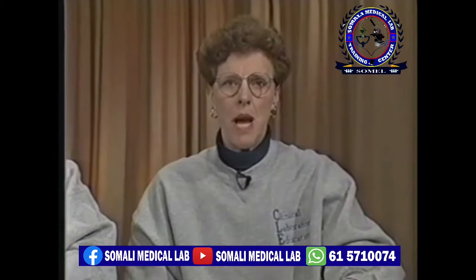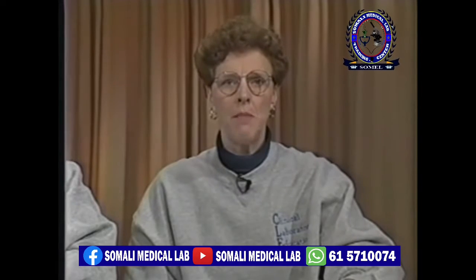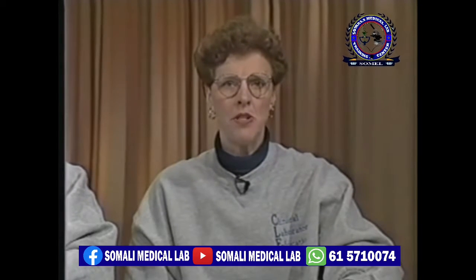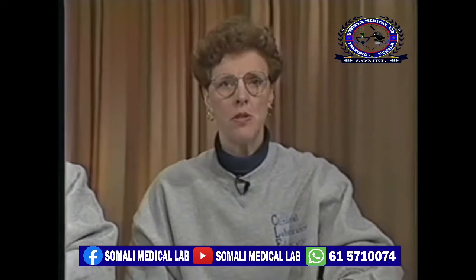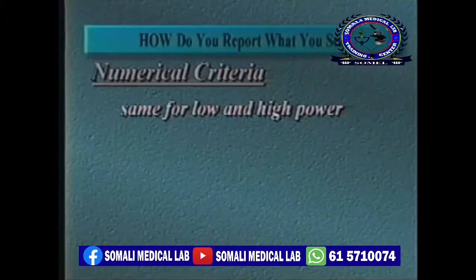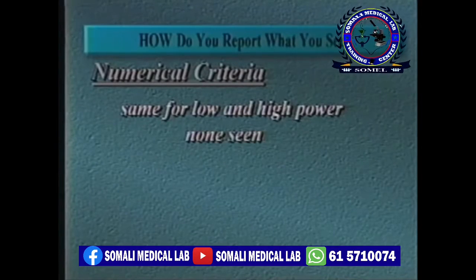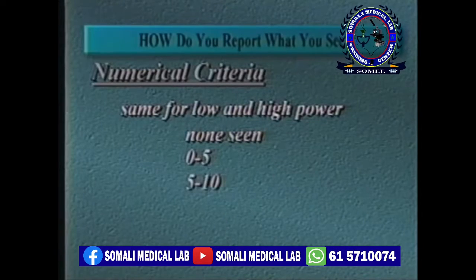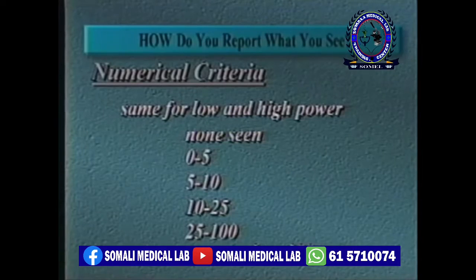For your institution, you may want to semi-quantitate bacteria as minimal amount present or large amount present. Some laboratories have many different ranges for reporting, while other laboratories allow the microscopist to create any ranges they choose. The numerical criteria we recommend is simple to use, clinically significant, and the same for both low and high power. It is none seen, 0 to 5, 5 to 10, 10 to 25, 25 to 100, and greater than 100.